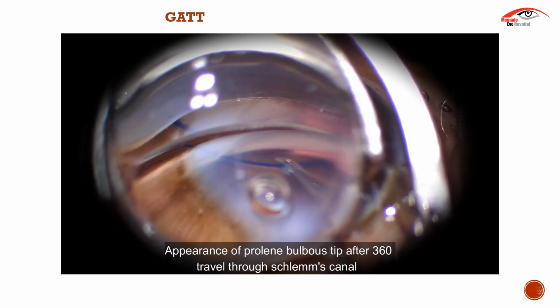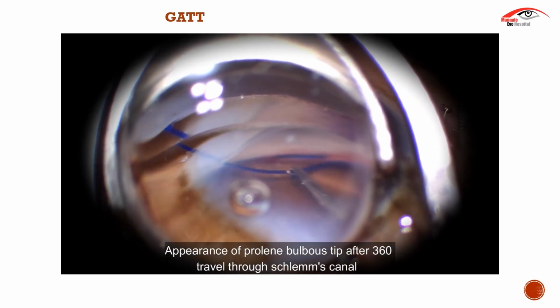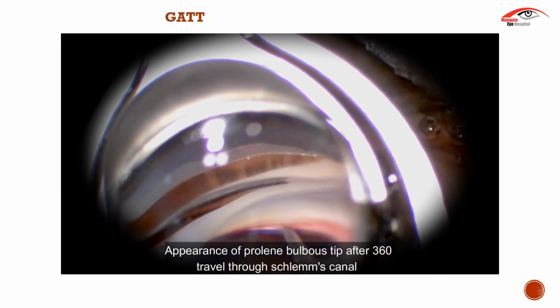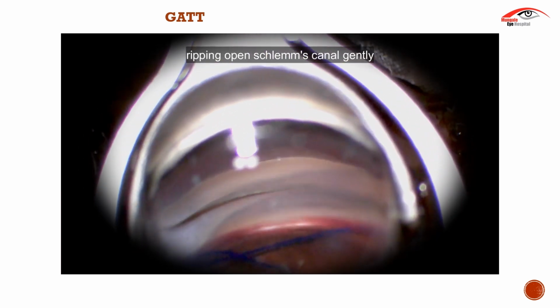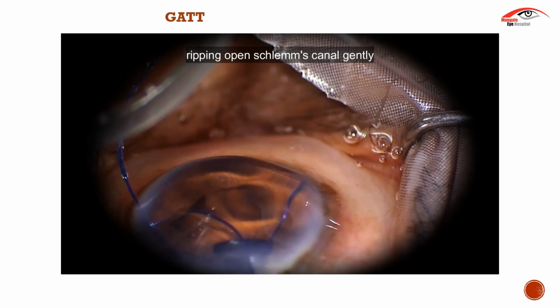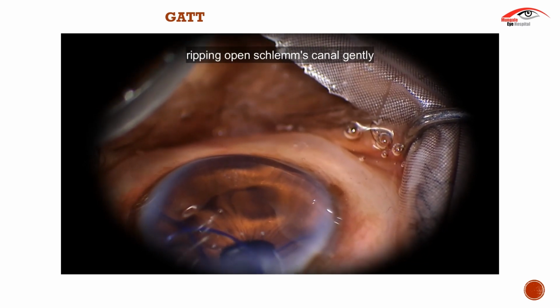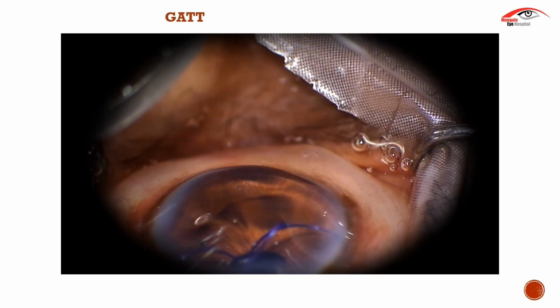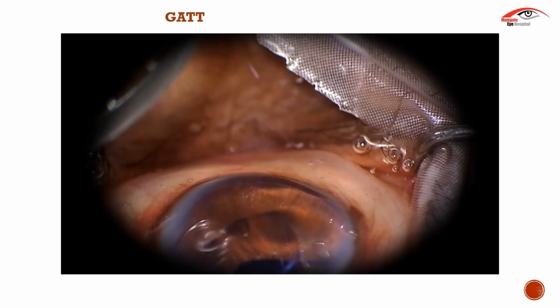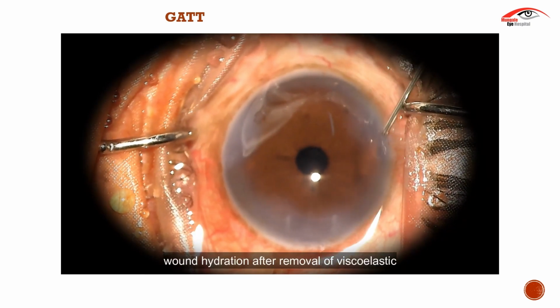The leading and trailing ends of the Prolene suture are gently pulled, ripping open the Schlemm's canal. After removal of the suture, the anterior chamber is washed with balanced salt solution and the wound is hydrated.